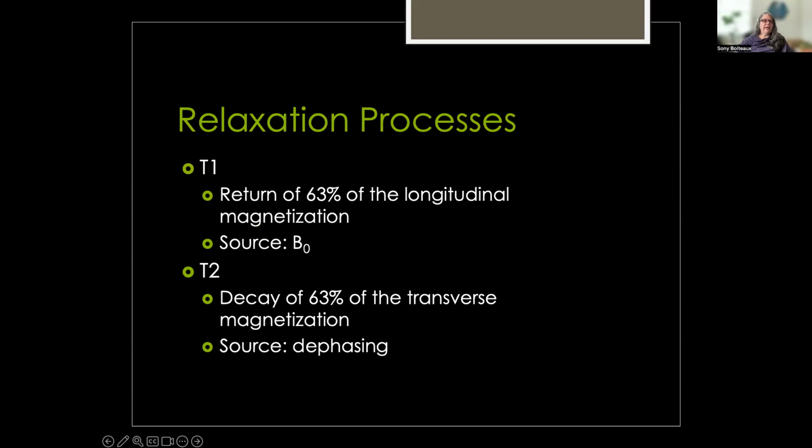So you can think of it initially as though they are aligned together and both pointing, say, at 12 o'clock. Okay, so let's say this is the magnetic field for my system and this is the magnetic field for my patient.